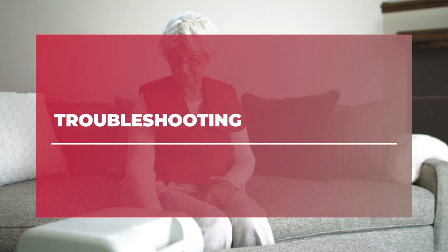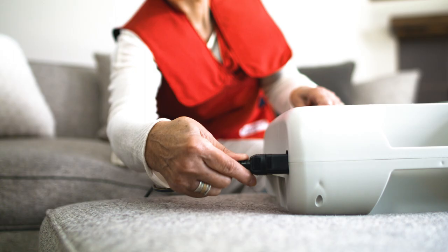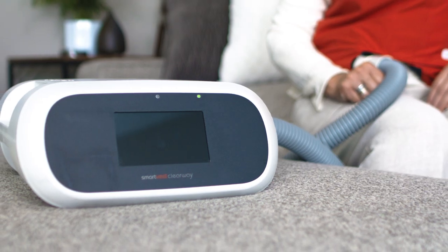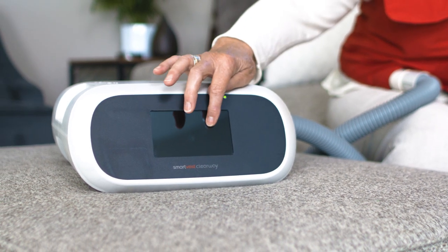If it appears that the SmartVest Clearway generator is not working properly, first check to make sure the power cord is securely plugged into the device and the wall outlet. Once you have confirmed the device is plugged in, tap the screen to make sure the device is not in sleep mode.